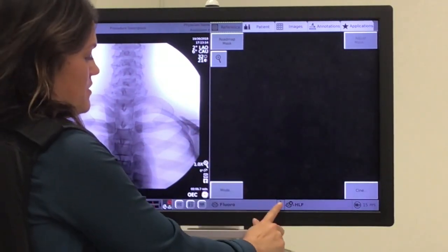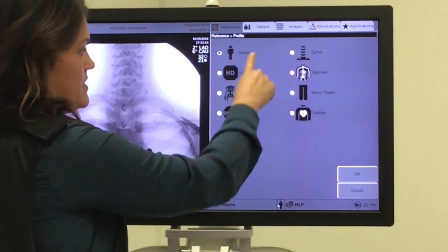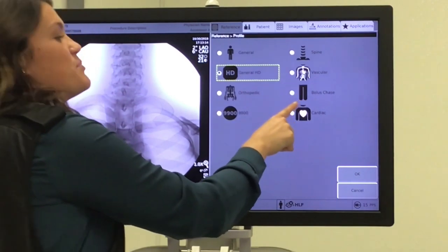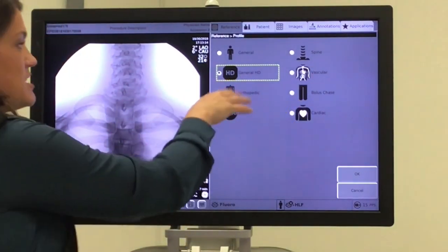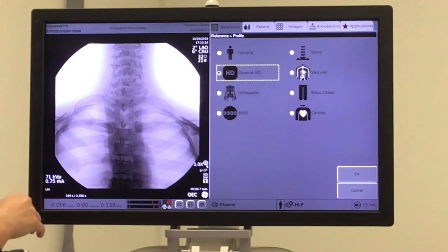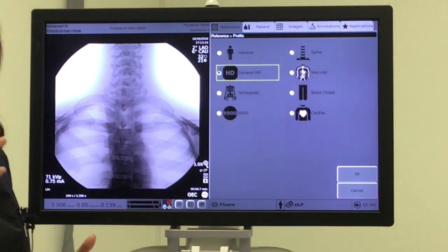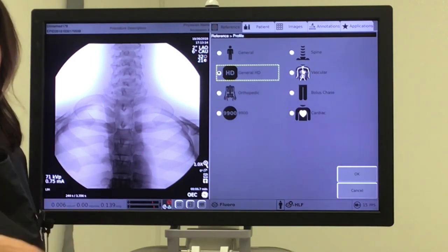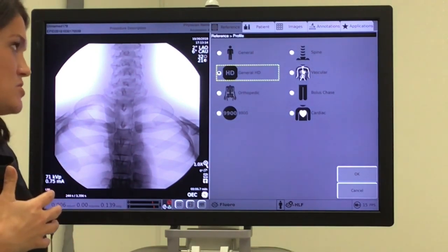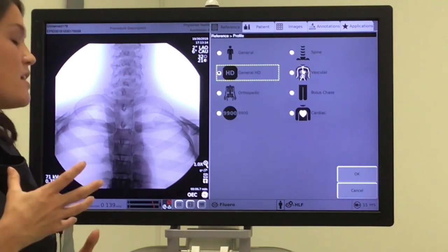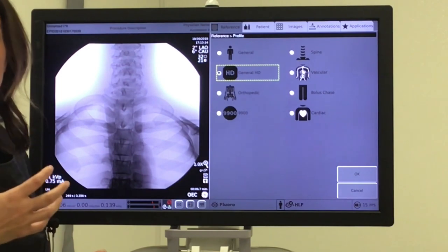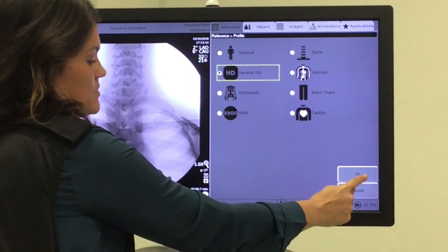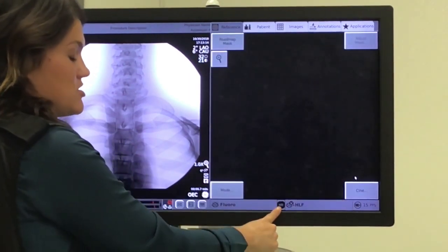Next on the list of profiles, we'll go down here to the status bar, click the icon, and select General HD. The General HD and the Bolus Chase profile are very similar. What the HD profile does is drop your edge enhancement, which makes it mimic a subtracted run or subtracted image. You're going to lose a lot of the bone detail and soft tissue detail, with the goal of making wires and catheters really stand out. We'll select it, hit OK, and our icon has now changed to HD.